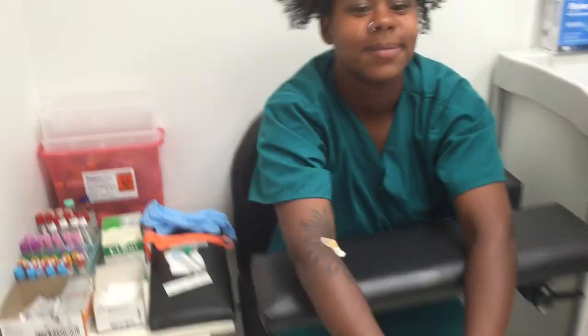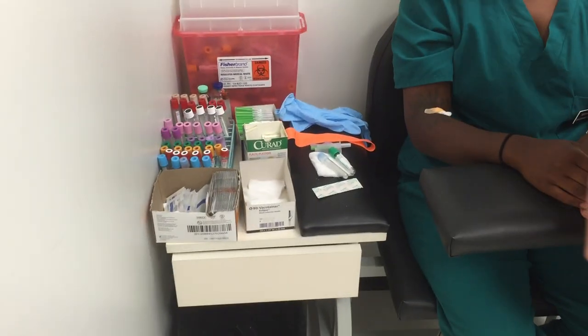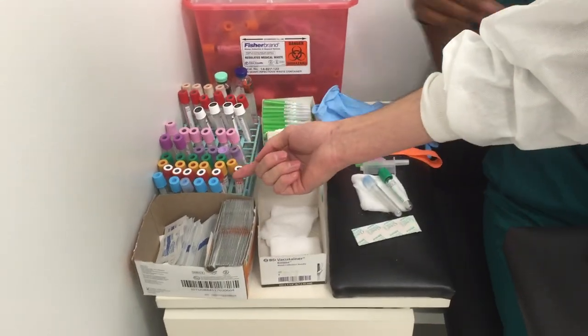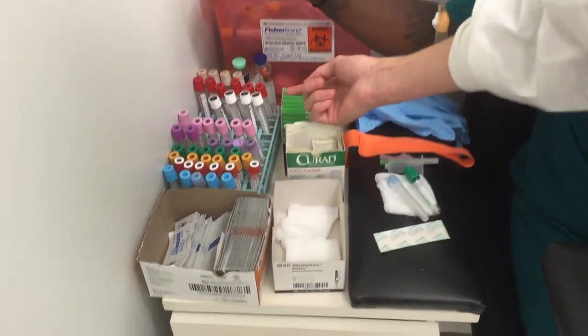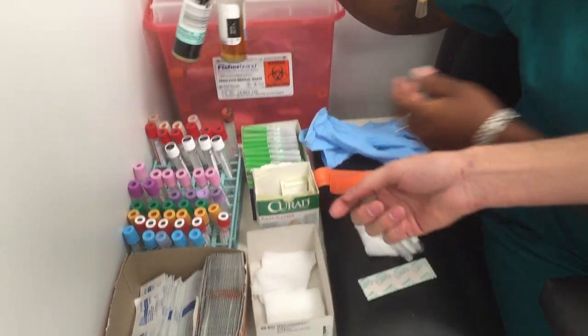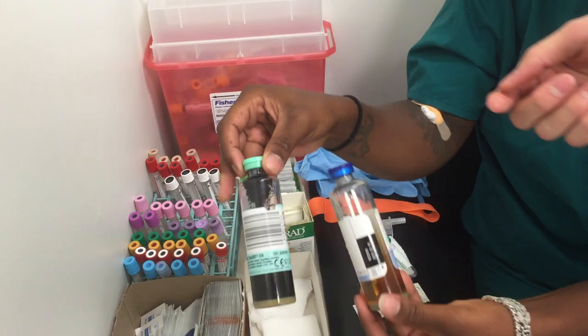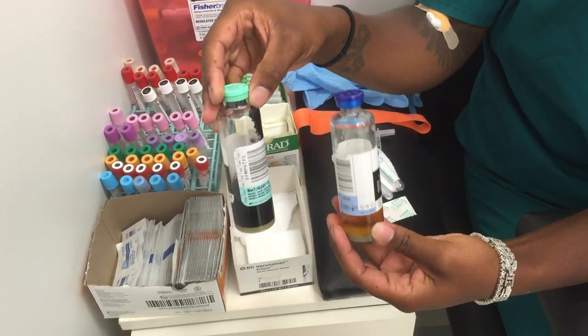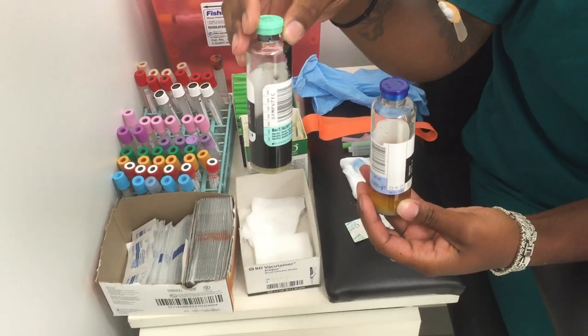Over here we have the tubes, which is the main part of this whole procedure. First, we have blood culture bottles. There are two types of blood culture collection bottles and they are anaerobic and aerobic. Aerobic would typically go first.